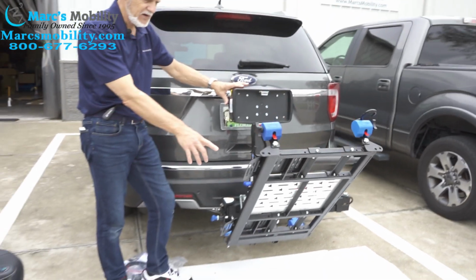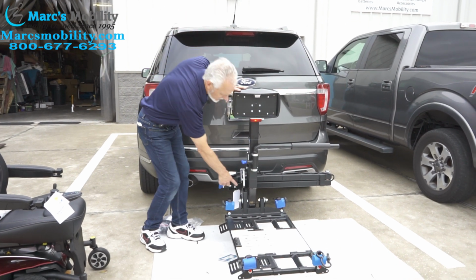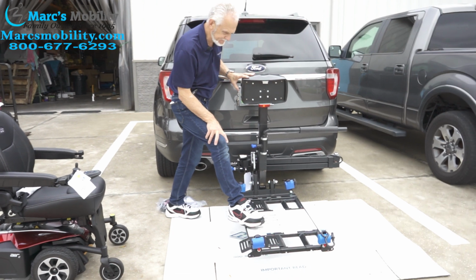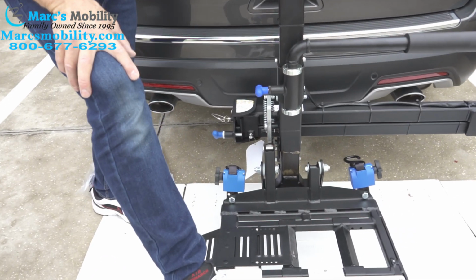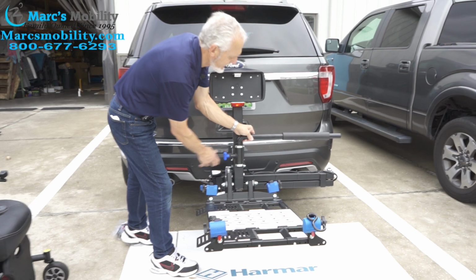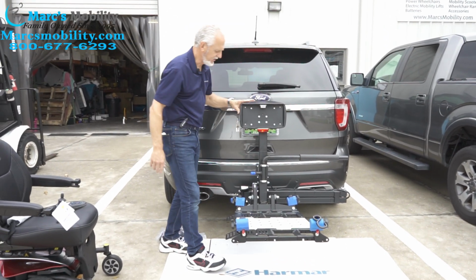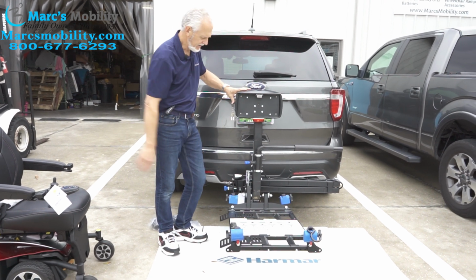Now, if there was a chair on here, the wheel would go in front. So if I put my foot down over here, you'll see the wheel go in front of it. Now you notice how it goes in front and the platform will not tilt at this point. And that's why you want to have your arm over your seat and you want to have your 4 straps. So, no chair on the platform, it'll tilt automatically.